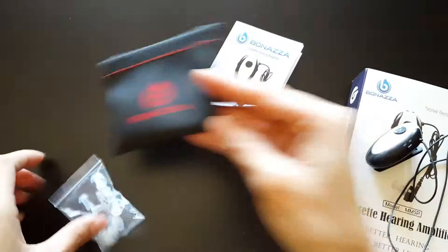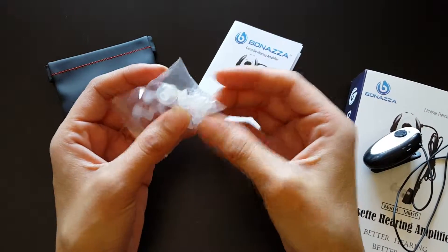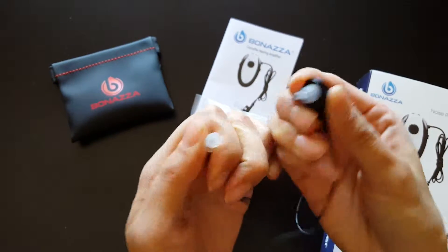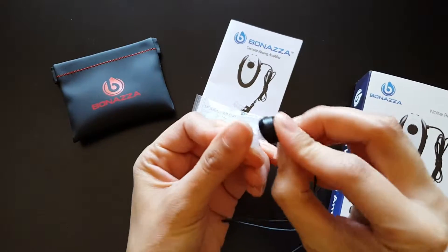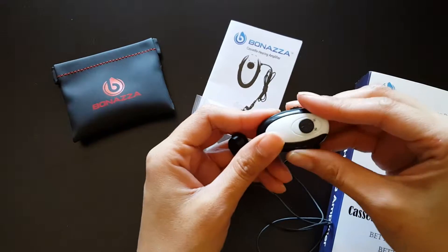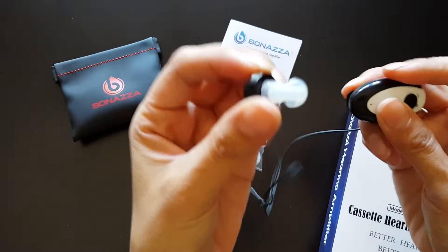It also comes with this little pouch and extra little hearing pieces — quite a lot since you only need one. To change it out is pretty easy — you just go like that. There are extra little pieces, and you just put in whatever piece fits your ear best. Stick it in, turn it on, and then turn the volume up or down.